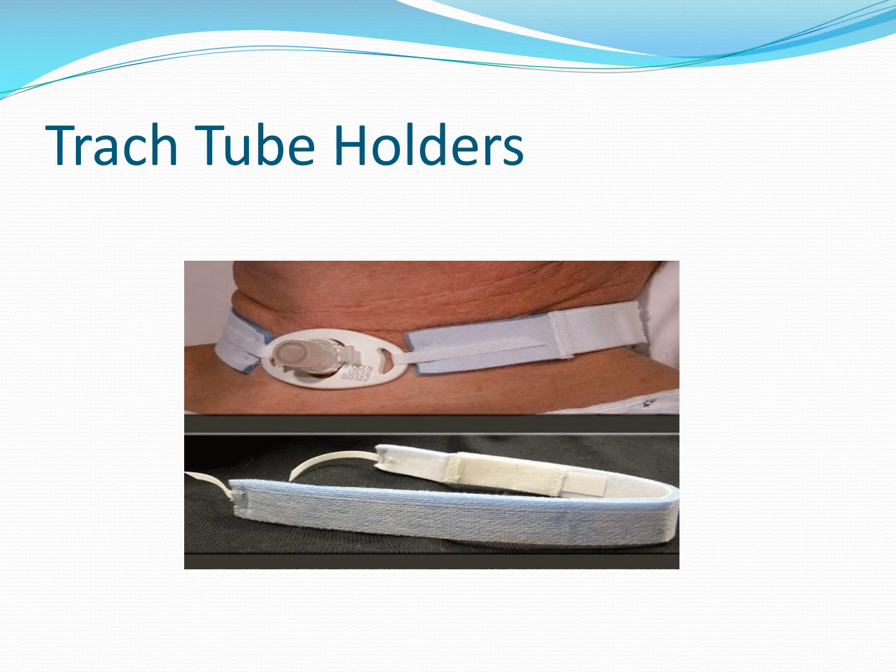So when twill is used, it really should be used temporarily, a day or 2 days. We have an ear, nose, throat physician who does a lot of bedside tracheostomies. He uses it universally, but also insists that it be taken out at day 2, and believe it or not, the sutures be taken out then as well.